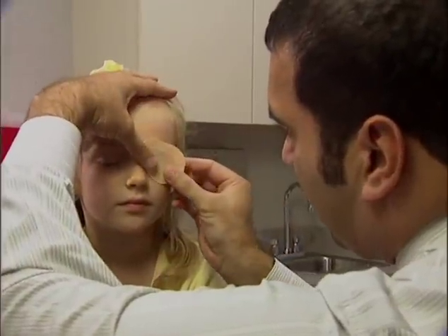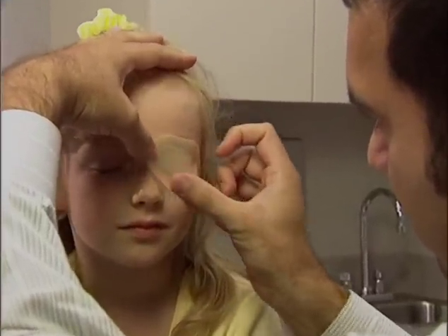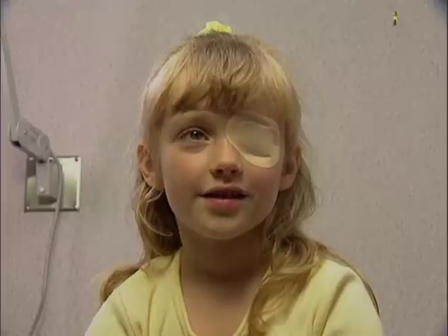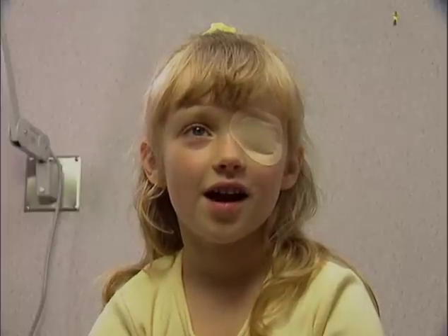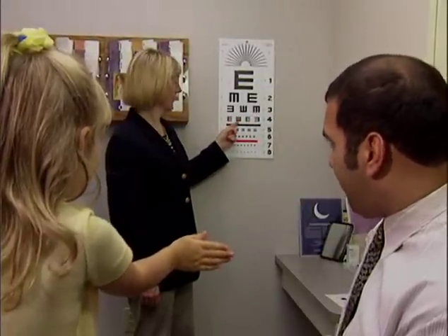Occluding the eye with tape or an adhesive eye patch is necessary because children will peek around their hand or a handheld occluder. Most children 5 years or older will be able to read standard Snellen letters or numbers. Many 3-year-old children will also be cooperative for the Snellen letters. Always ask the parent and child if they know the alphabet. The tumbling E chart can also be used with a pre-literate child or with an illiterate adult.